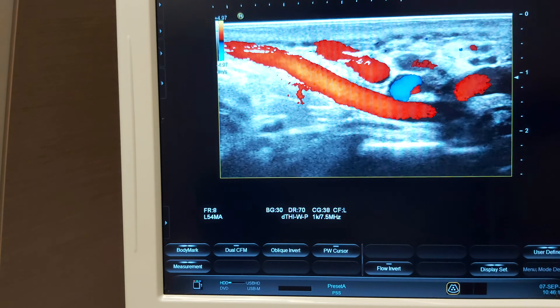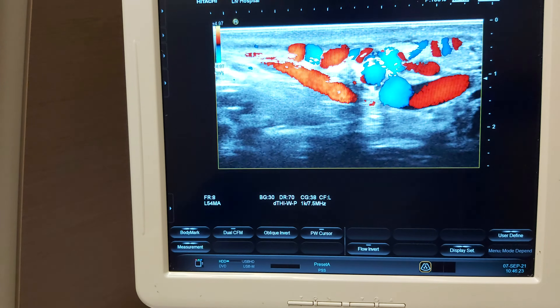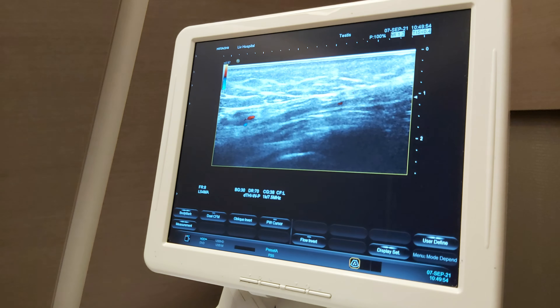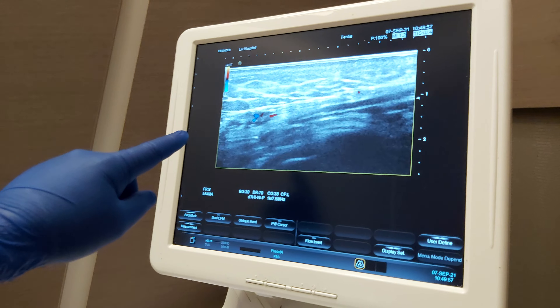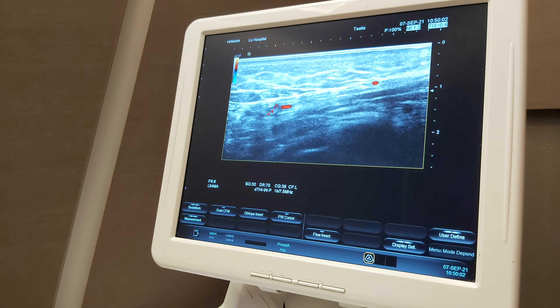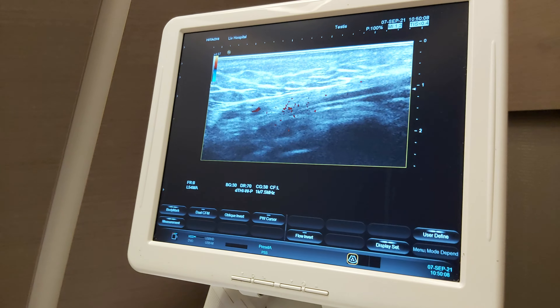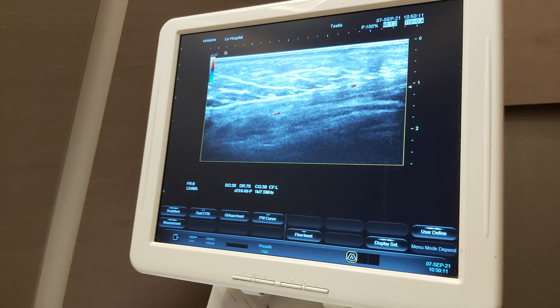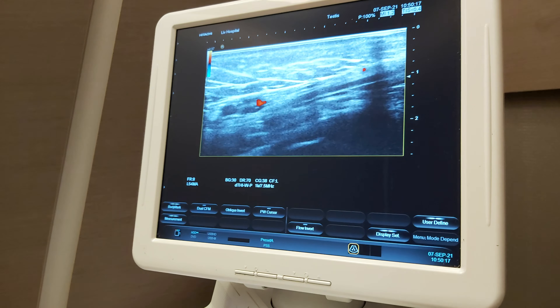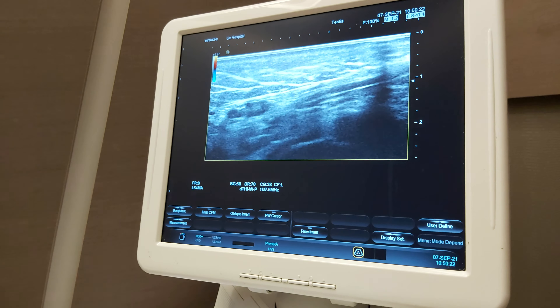This is an obvious varicocele — we will take this vein out. One more thing: I will search your arteries. Now I am checking the artery. The red pulsating one is the artery — it's important in the procedure to find this with the microscope, and we use a microvascular Doppler device. We control all the vessels to see if there are any more branches or sub-branches of the artery, as they are important in the procedure. It seems like you have one main artery, but we will control all of these.